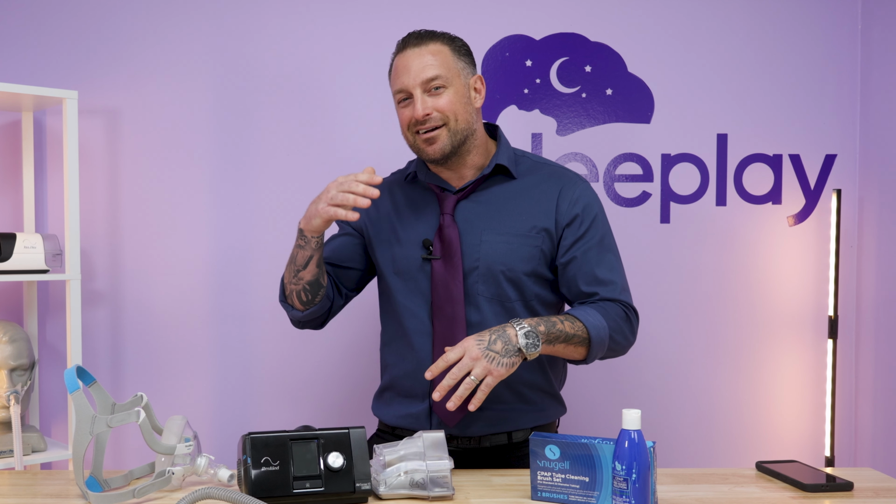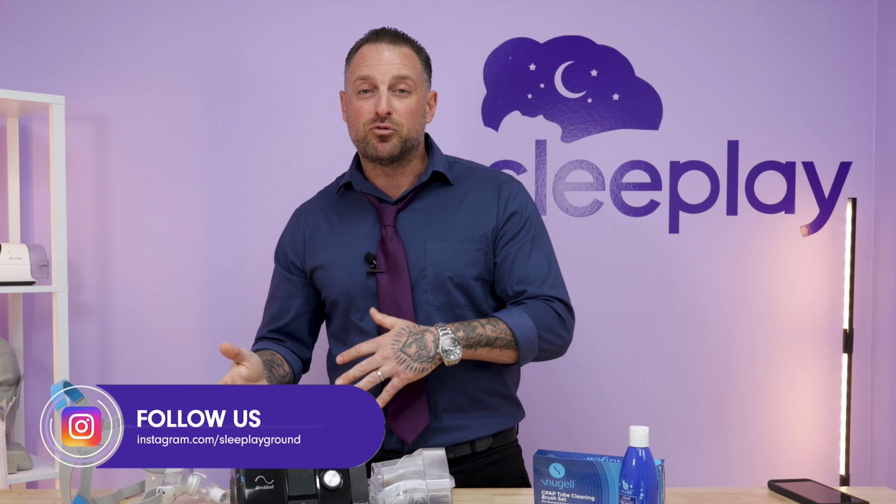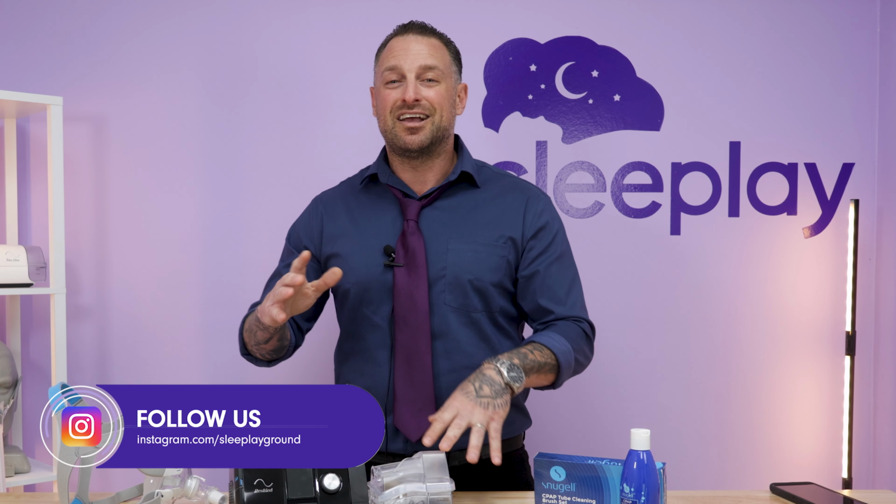So folks, I was being very serious at the beginning when I said routine work makes the clean work. It really does. So make sure you are setting up a routine in cleaning, okay? You've got the tubing, water chamber, headgear, and frame weekly. Check the filter as well if you want to, just to stay on top of it.